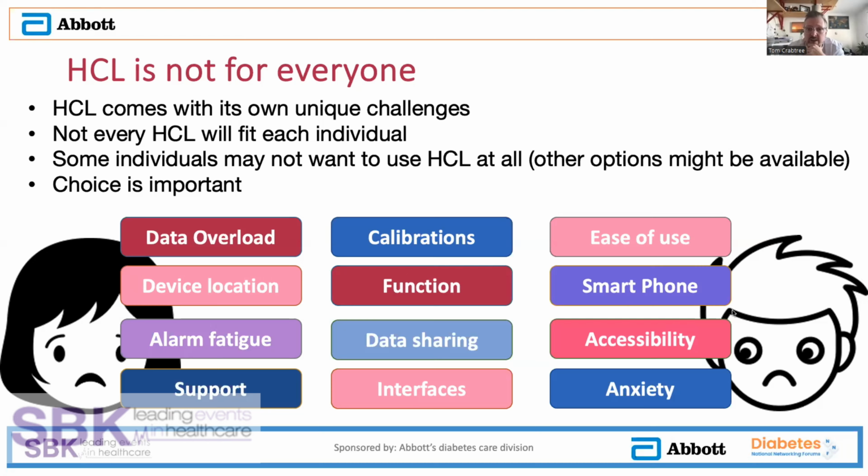But ultimately, we live in a world where choice is incredibly important. And I think if we can get a person to choose the closed loop and be guided towards the choice that they want, they feel then more invested in that technology because they feel like they've had more choice over the system they're using.